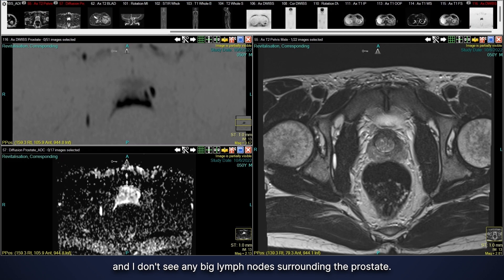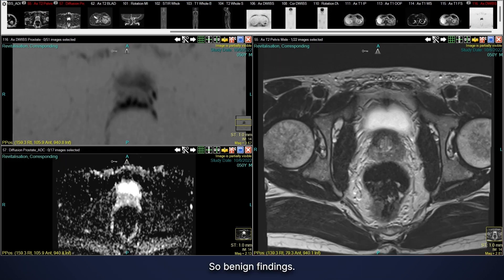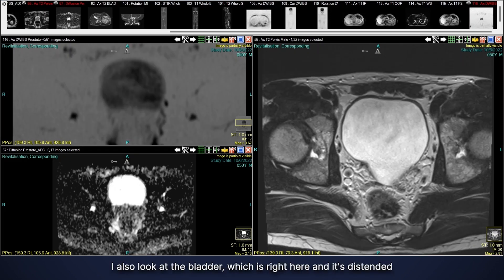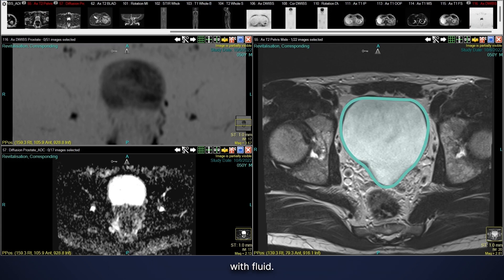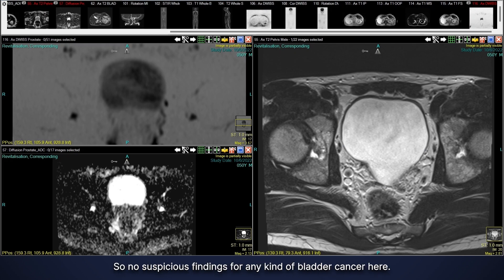I also don't see any enlarged lymph nodes surrounding the prostate, so overall benign findings. Looking at the bladder, it's distended with fluid, has a nice thin wall, and I see no filling defects — so no suspicious findings for bladder cancer either.